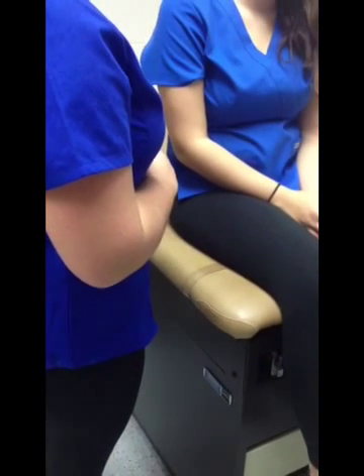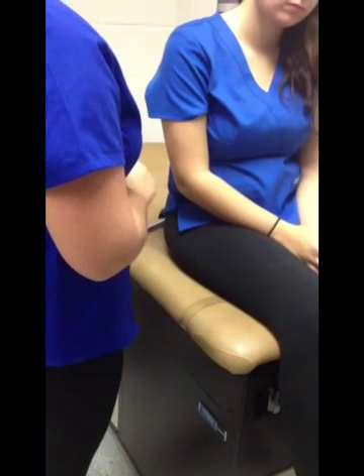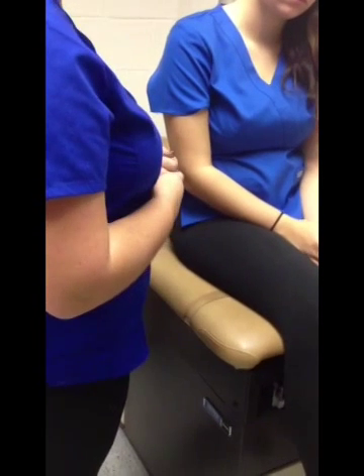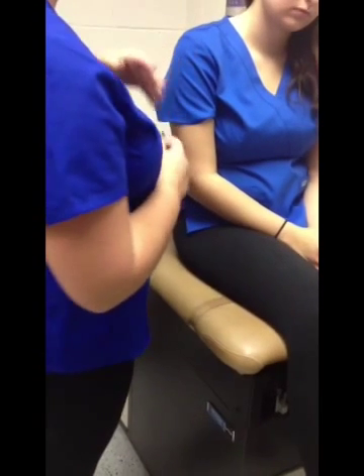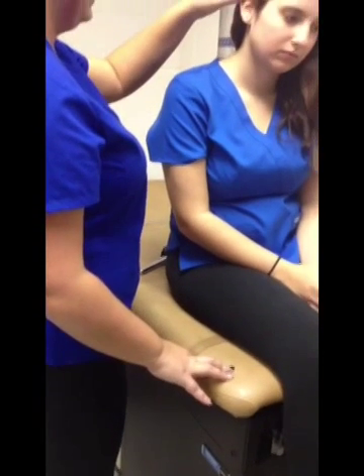Before using the otoscope to observe the eardrum, you need to observe the ear as a whole, and you're going to look at the ear and see if there's any signs of disease that would link to the patient's symptoms. After observing the ear, you're going to look at the external auditory canal. You're going to start by pulling the patient's ear gently up and out to see the whole ear canal. It should be a pinkish color, the color like your skin.